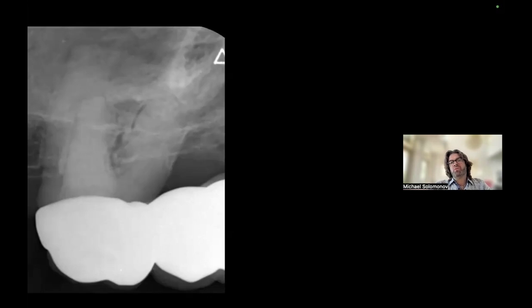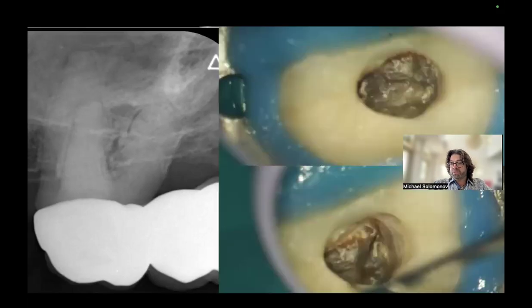And of course, the question for clinician, if to refer firstly this case to CBCT scan or to start the treatment. A very important fact is that CBCT will not show us canals with a diameter less than file number 10. In my opinion, first we start endodontic treatment, and just in case, if it is impossible to find the canal, we refer the patient to CBCT. And I did it. I started the treatment, and it was a very challenging case.